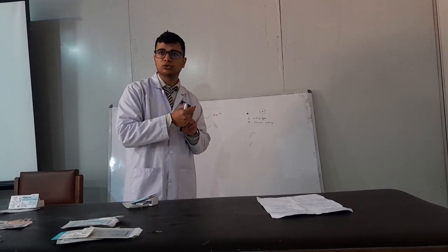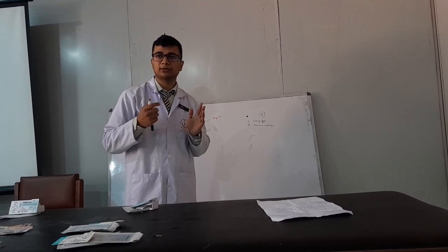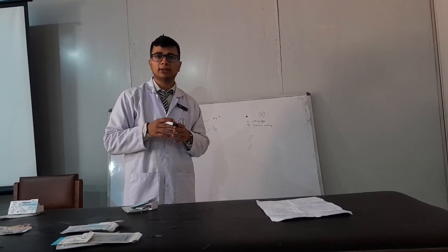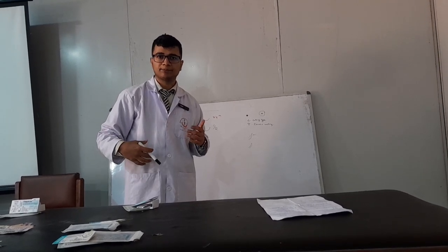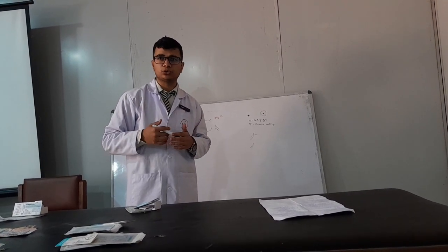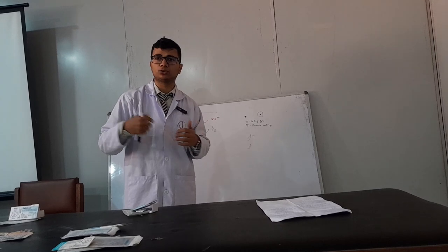However, non-absorbable sutures won't be absorbed and they will last, so we need to cut the suture out. However, in case of absorbable sutures, we need not remove the suture. So in which cases do we use which? Suppose we have bowel obstruction and bowel gangrene, then we resect the bowel. Now we have to do re-anastomosis. In this case, we use absorbable sutures, because next time we need not go inside the abdomen once again to remove the suture.